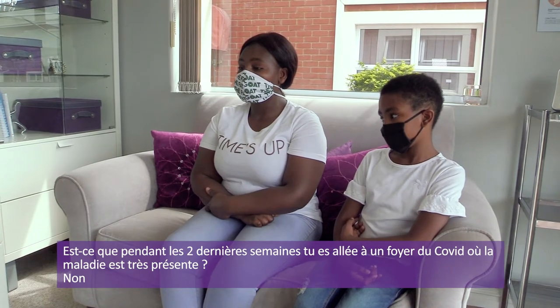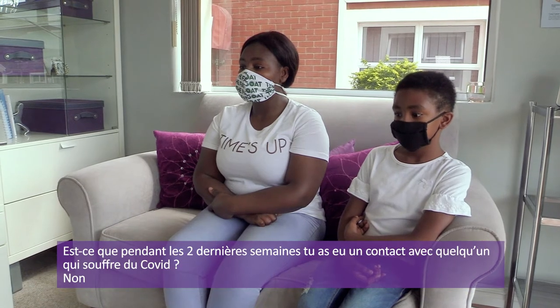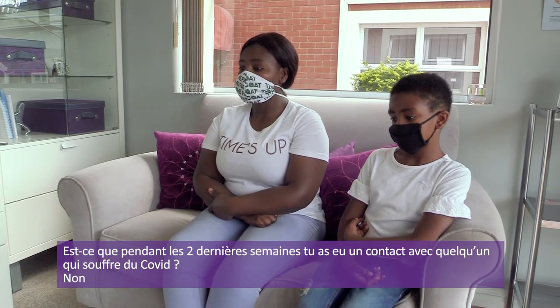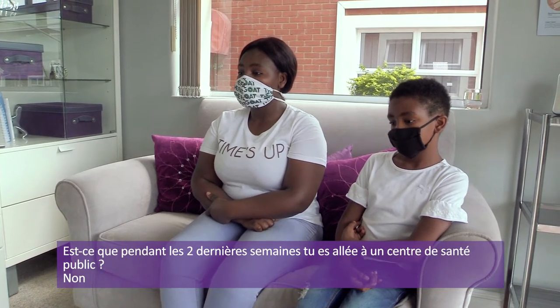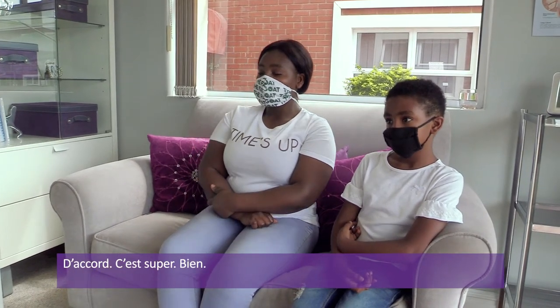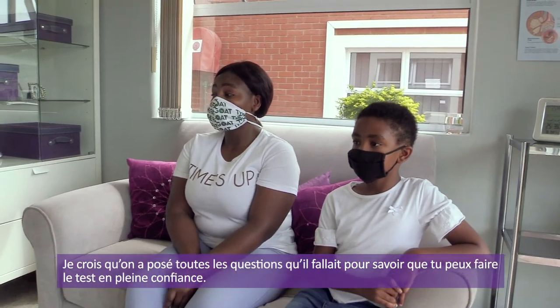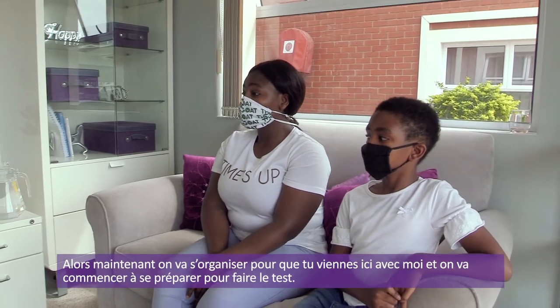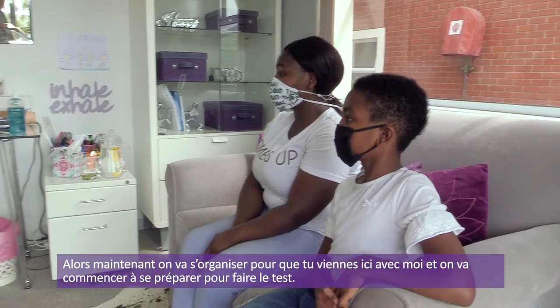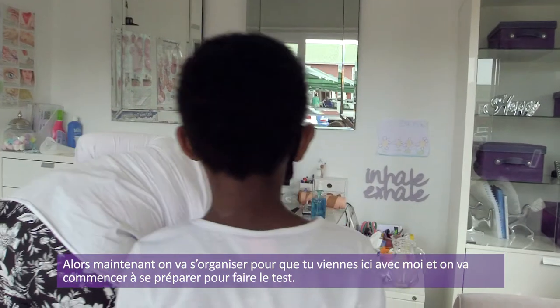In the last 14 days, have you traveled to any COVID hotspots? No. Have you been in contact with anyone with COVID in the last 14 days? No. Have you attended any healthcare facility in the last 14 days? No. Okay, super. All right, good. So I think we've covered all the questions that we need to make sure that it's safe for you to blow. So now I'm going to set you up to come forward so that you can be with me. And we're going to start looking at doing the test itself.